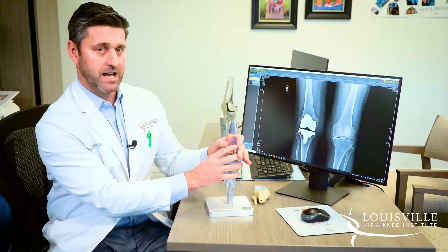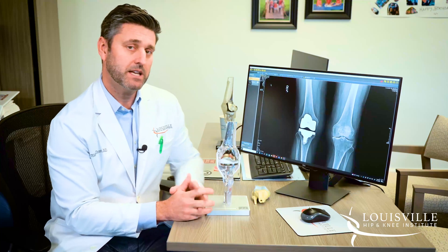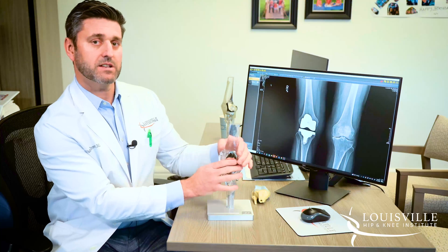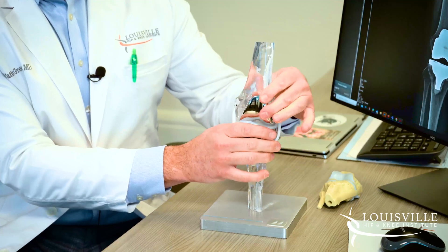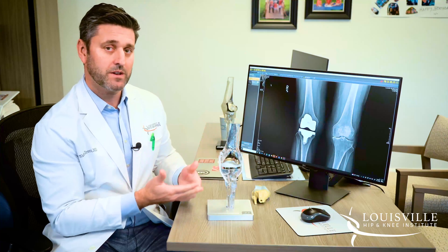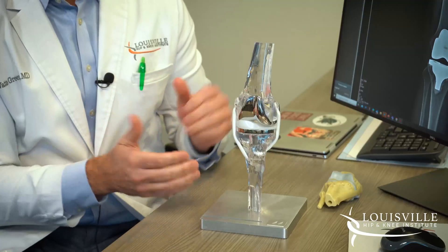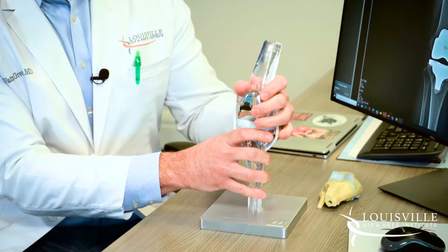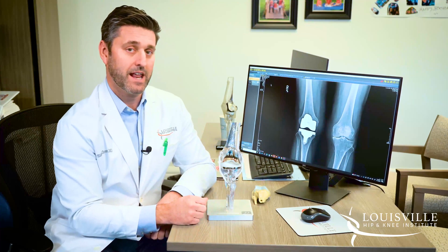I typically use Medacta, a Swiss-based implant company based in Nashville, Tennessee. I love their implant because it's very similar to normal human anatomy. The inside part of the knee pivots and moves while the outside part is able to rotate and give you a good arc of motion — very similar to your natural anatomy as a teenager. The Medacta medial pivot design allows that inside part of the knee to pivot and the outside to have a good range of motion. This is the closest knee implant to your normal native anatomy.